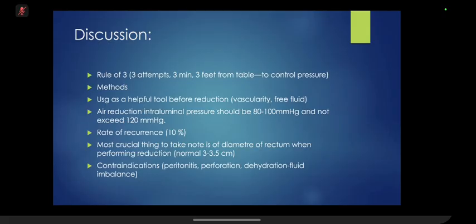So in this case, we already knew that the patient has intussusception, and the candidate told us very clearly what she will do next: she will try to rule out the possibility that the patient is having any free gas, any ascites, and any ischemia of the bowel. So everything she will rule out, and then the next step is to reduce the intussusception. Why is it important? Because all these things complicate it, and they have a very low prognostic value, because even if you try with those methods, you might not be successful.